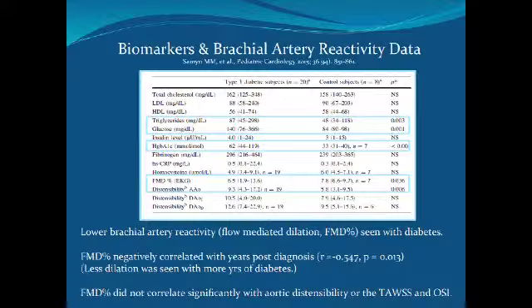Our first control was a patient with tetralogy of Fallot, and we stopped using those patients because although they're our most frequent flyer at the scanner, some of them do have dilated aortas. And so we felt like we would be critiqued as we submitted this for publication if we had too many that might have dilated aortas. So we went to patients with chest wall deformities, arrhythmogenic right ventricular dysplasia, but they didn't actually have it, VSD, mild pulmonary stenosis, and an anomalous coronary that had been repaired. And so these kids were consented as they came to the scanner.